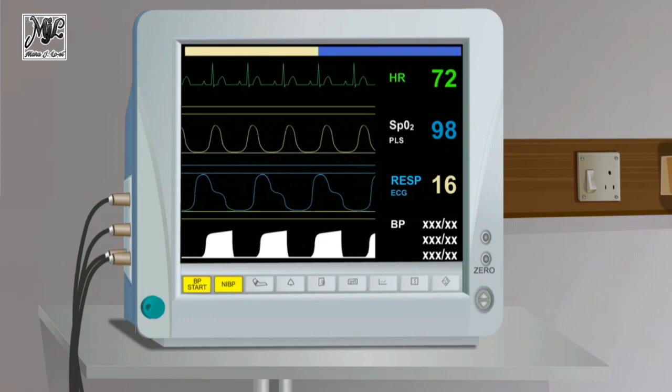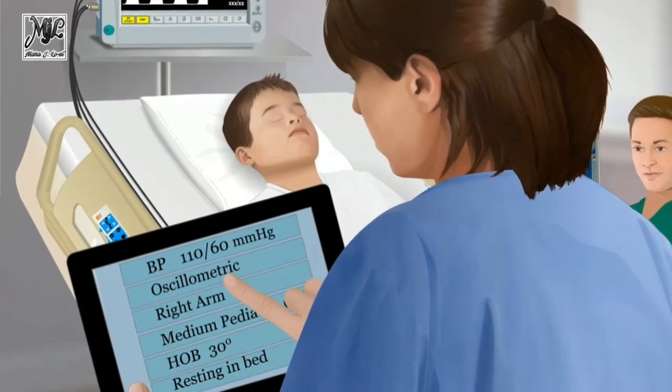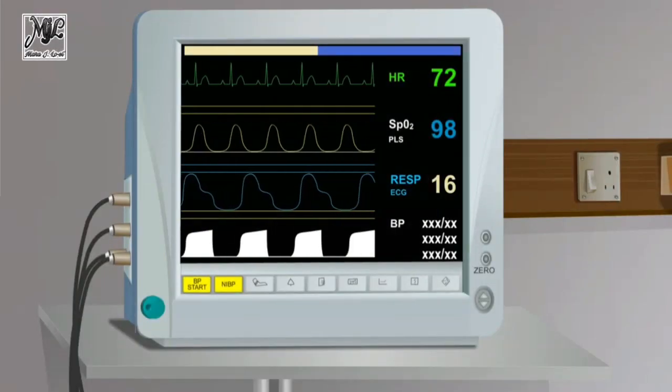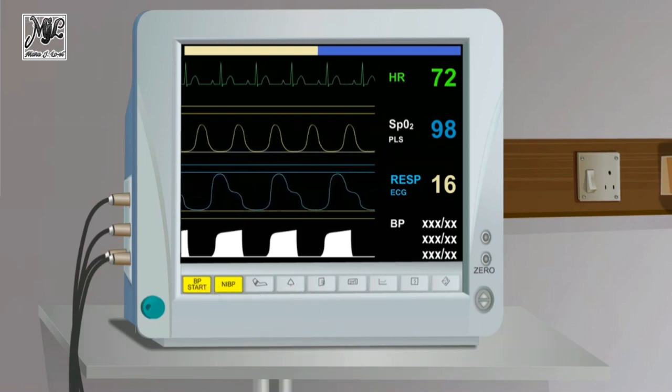Record measurements for the systolic BP, diastolic BP, and the mean arterial BP. If the BP measurement is elevated, measure BP using the auscultatory method. If the oscillometric device is used for ongoing BP monitoring, set up and activate the appropriate alarms.